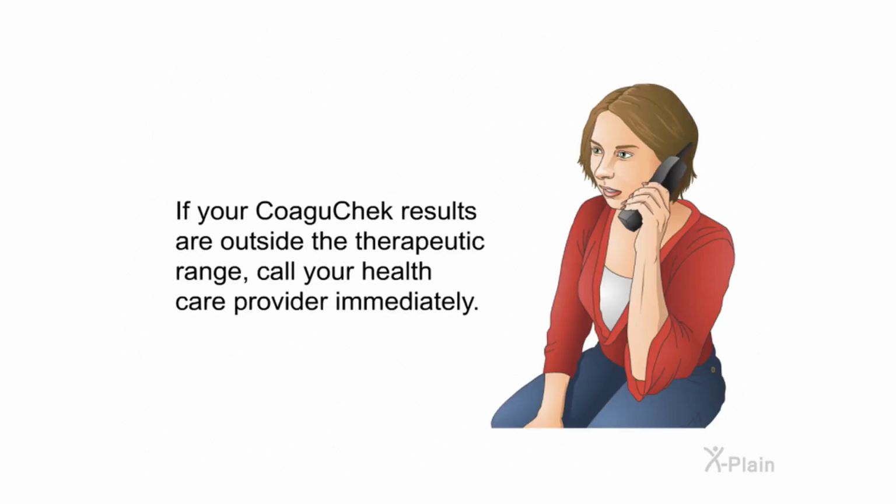If your CoaguChek results are outside the therapeutic range, call your healthcare provider immediately.